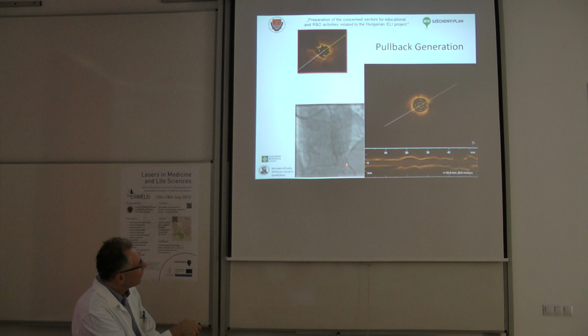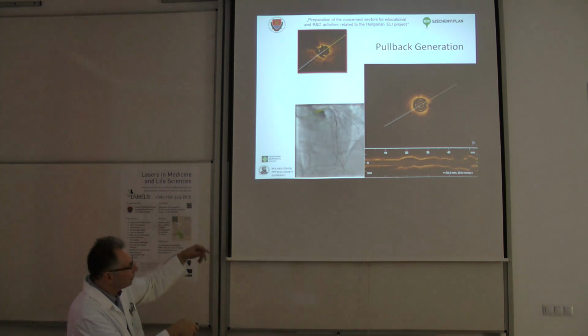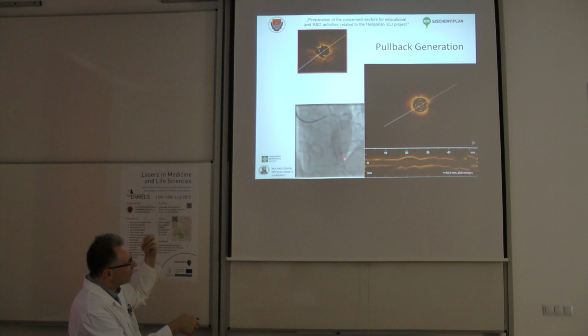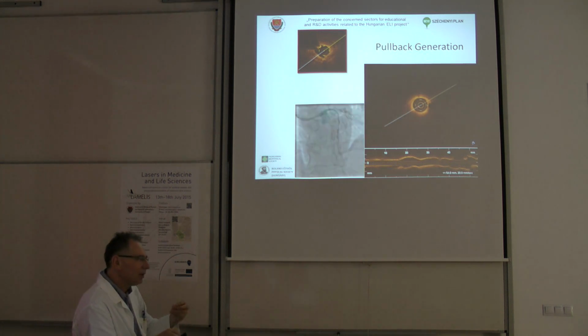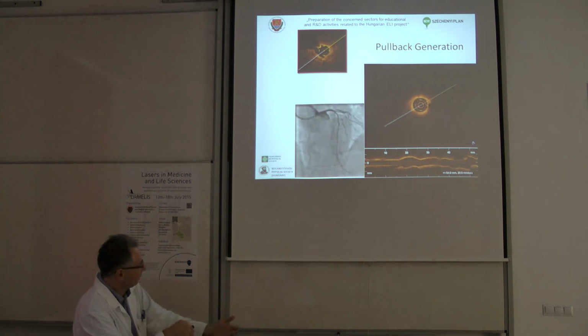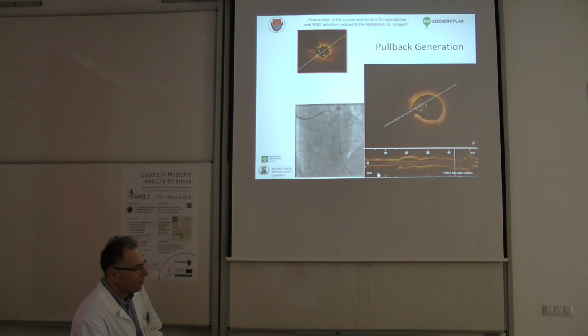So we need to always observe where our catheter is. It cannot exceed this wire, otherwise it's very dangerous. It cannot penetrate. And there is a so-called monorail tube. It is a previous generation of the catheter. It was around 3 centimeters, a so-called monorail segment, which is only meant to be able to track the catheter down to the distal part of the coronary artery. So you could never introduce the OCT probe without a wire. Never.